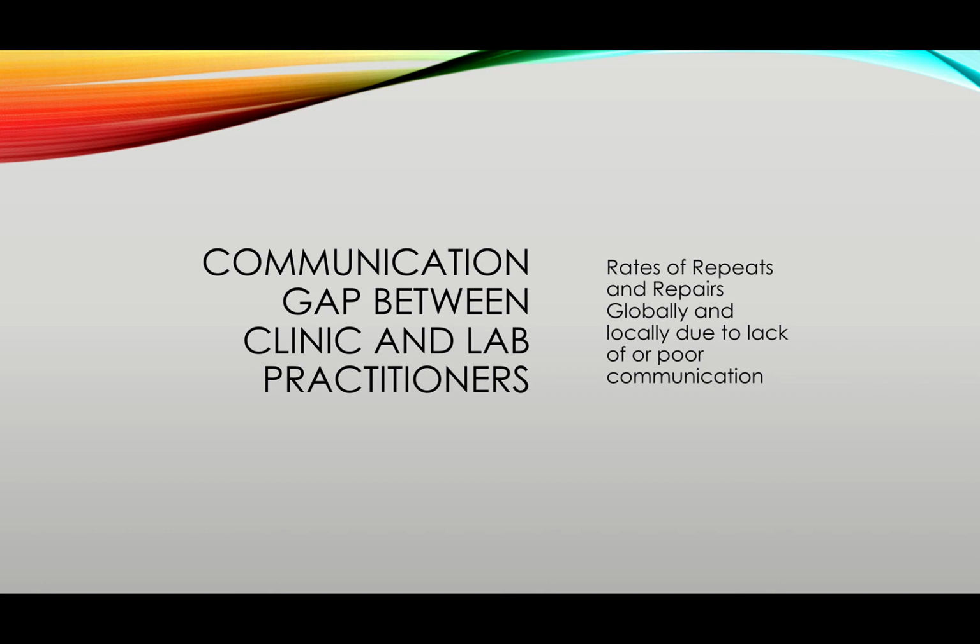Because layered, yes, you're giving nicer aesthetics, but for sure, by the numbers and statistics that I showed, you are giving a much weaker prosthesis to the patient. So you have to think, if he's a younger patient, do they have strong occlusal forces? Do they have attrition, night grinding?